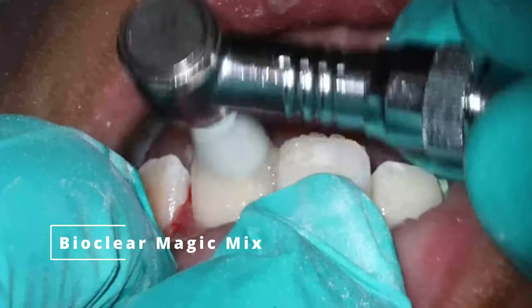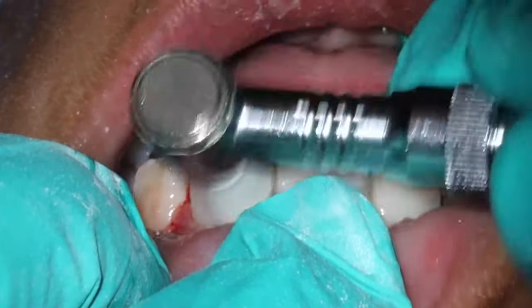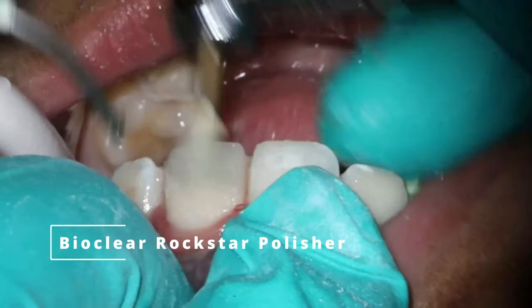So at this point, happy with everything, going to go in with the Bioclear Magic Mix, which is kind of like a prophy paste, but it does a nice job of smoothing off those surface scratches. And then we finally come in with the Rockstar Polisher, which makes just an absolute beautiful result.